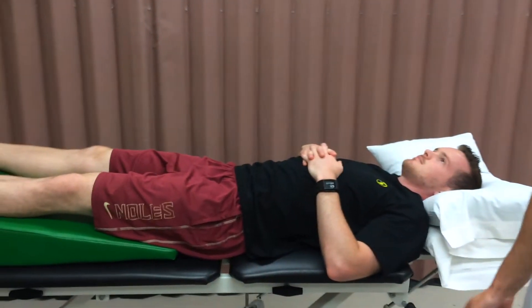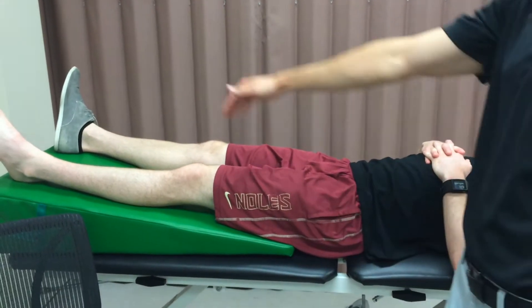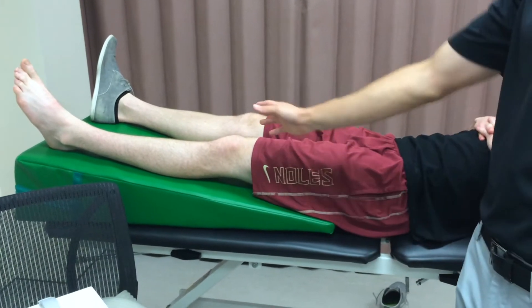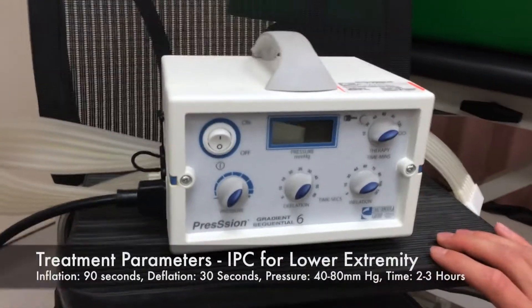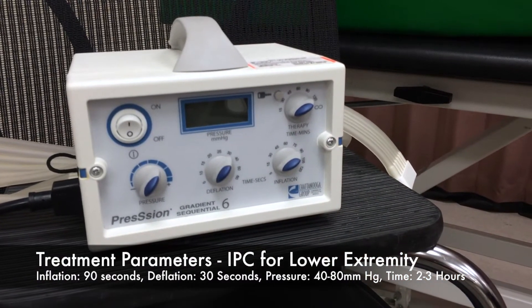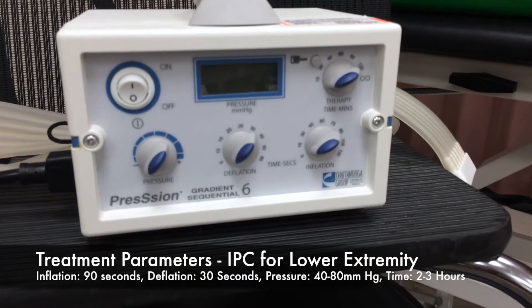We have Kenny here in the supine position. His legs are bolstered up and elevated to increase the venous return back from the distal. As far as treatment parameters are concerned, we're going to use an inflation to deflation ratio of 3 to 1 for the lower extremity — 90 seconds on of inflation, 30 seconds off at deflation.